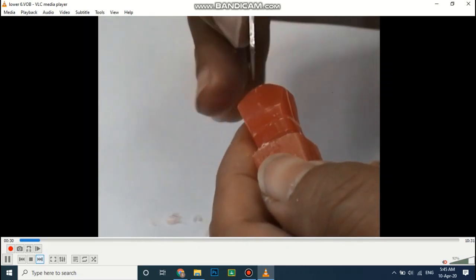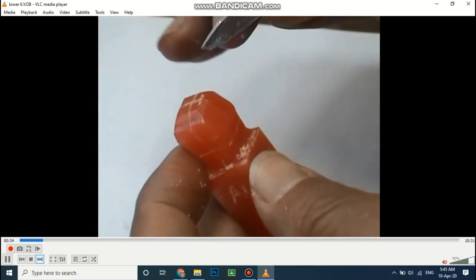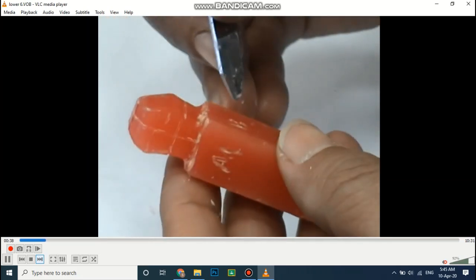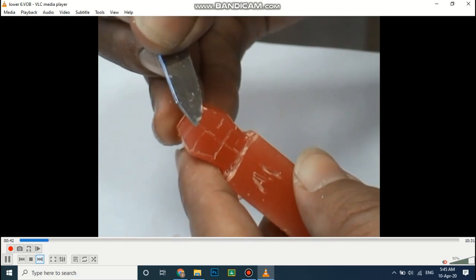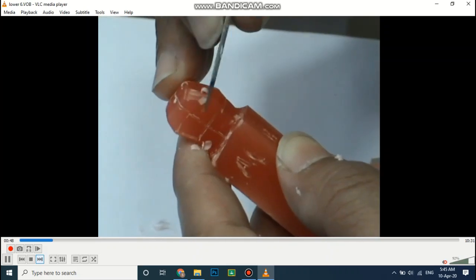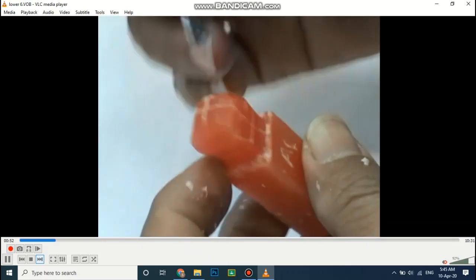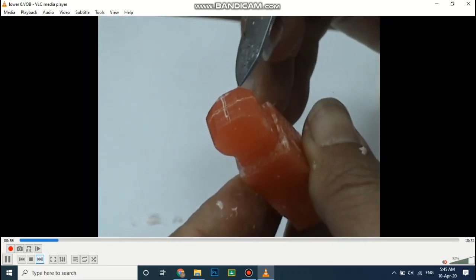Adjustment of the cervical ridge is done this way to avoid any step or concavity above the cervical ridge, creating the buccal surface to be two surfaces now. At the mesiobuccal line angle, we are performing a bevel. By this bevel we have the buccal surface in 3 levels: 1, 2, and 3.